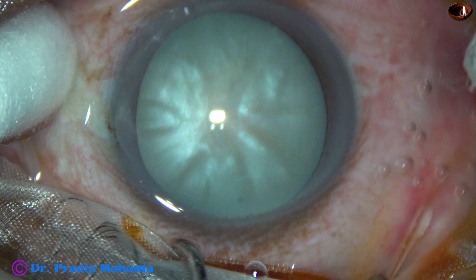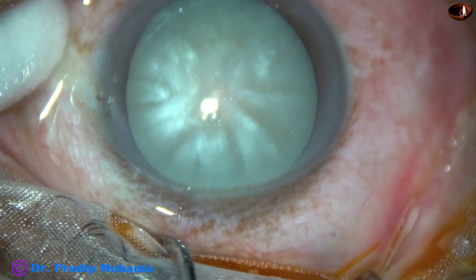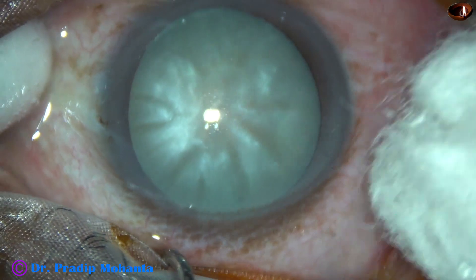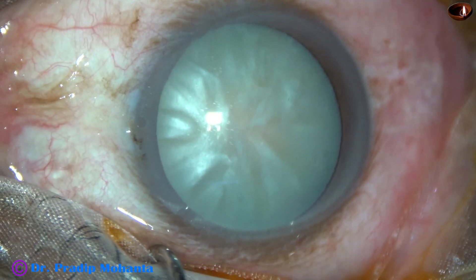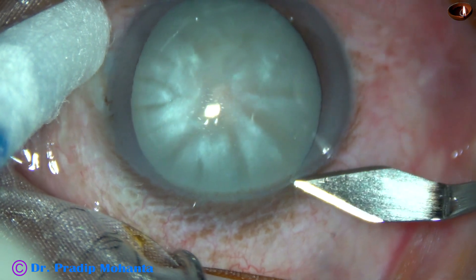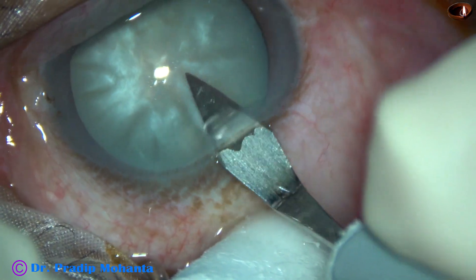This is an intumescent cataract. We can see fluid collection inside the lens. We know that in intumescent cataracts, the intralenticular pressure is high, and due to this high intralenticular pressure, the most anxious step of this surgery is capsulorhexis. Let us observe this surgery. This is a very slow surgery to demonstrate all the steps very clearly.